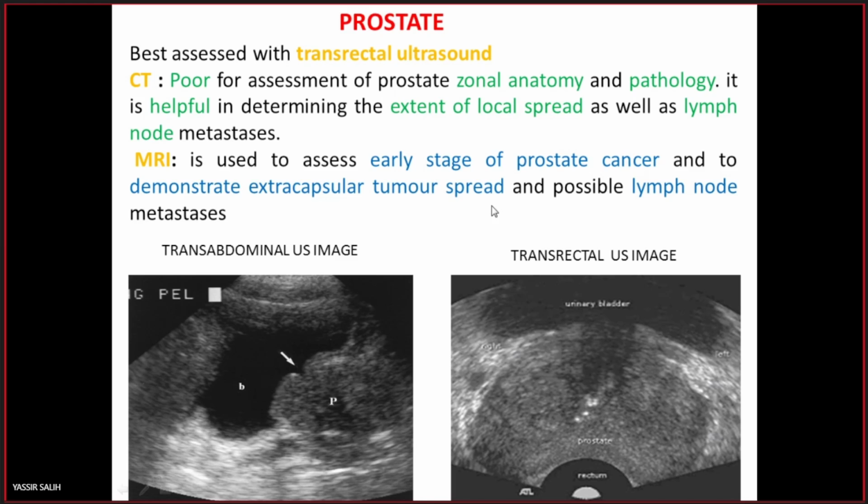To conclude, the best imaging technique for assessment of the prostate, for example prostatic cancer or any other pathology, is transrectal ultrasound.